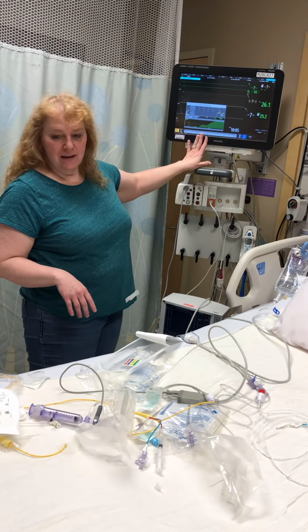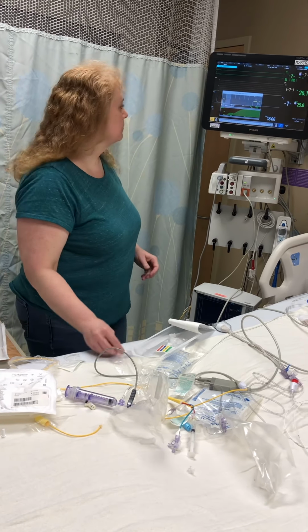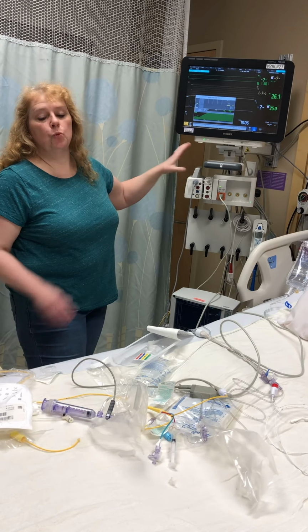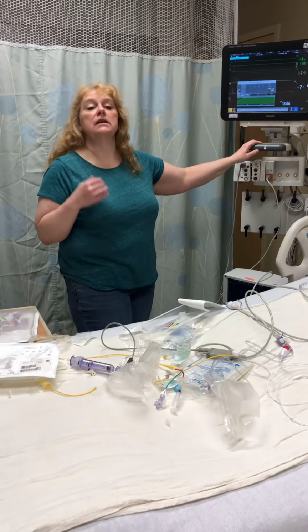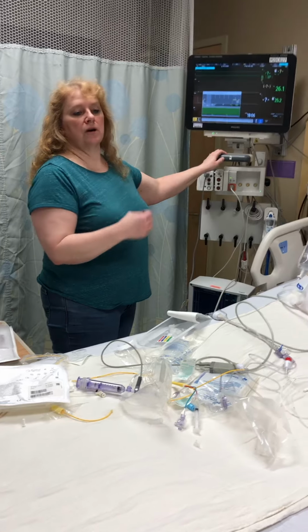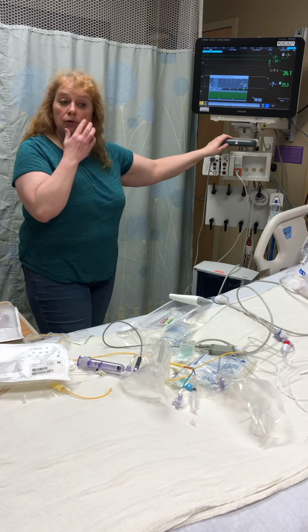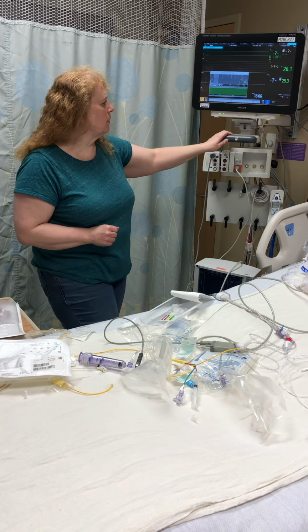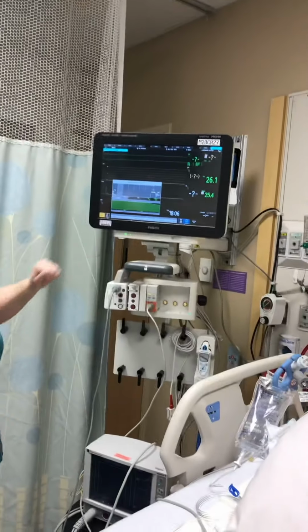You're gonna go through 3 of these, and you're gonna get the average. And then in here too, once you get your cardiac output and your index, you'll be able to do hemodynamic calculations, and it'll give you a little bit more information than just your pulmonary artery pressures, your CVP numbers, and your cardiac output. It'll be able to give you things like your SVR, which is important, and I'll give you a quick basic on that. So we're gonna want 3, and it'll average it, and then we'll enter it when it's done.